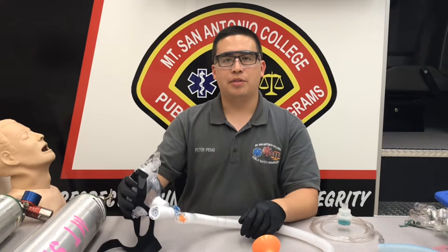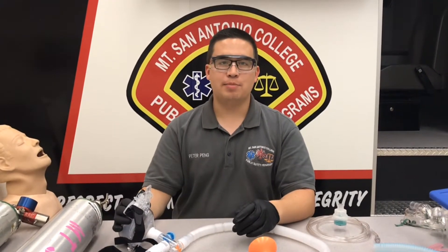I'm going to demonstrate how to administer albuterol through a nebulizer in line with your CPAP. We would typically do this for patients who have bronchospasm but are in severe respiratory distress to where they need to be on CPAP. First of all, I have my VSI on, I have my gloves and goggles, and our scene is safe.